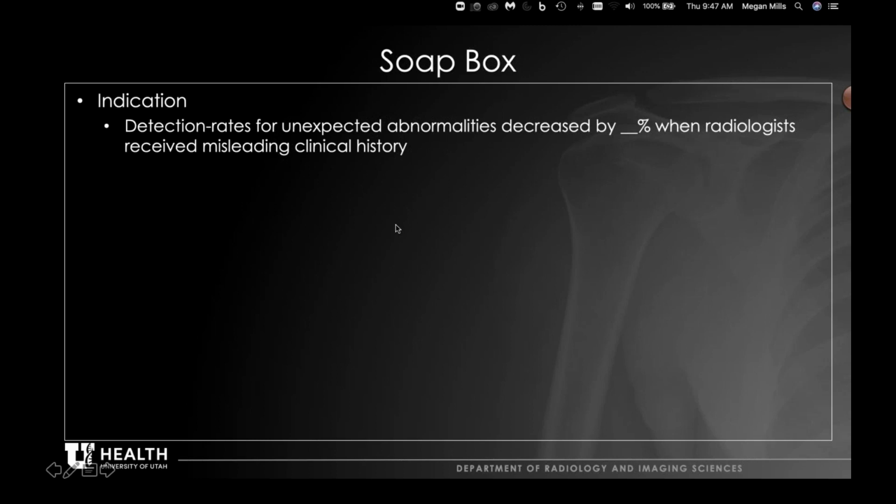33. 33, love it. It's actually pretty close. It's about 40%. So if we're given the correct clinical history, we have a much higher chance of making the correct diagnosis than not. And this was true for a number of people. I think we tested about 40 radiologists in this particular study, and you can see that it has a huge impact. So whether you're going into radiology or not, always remember to enter a correct clinical history. It can only help your patients.